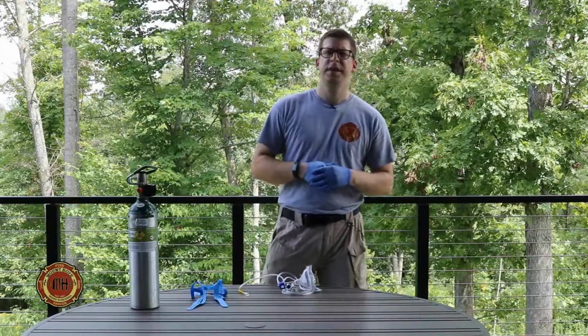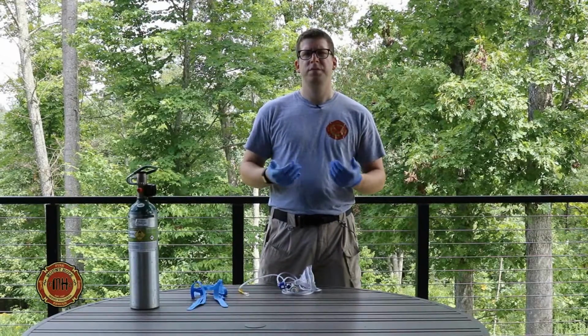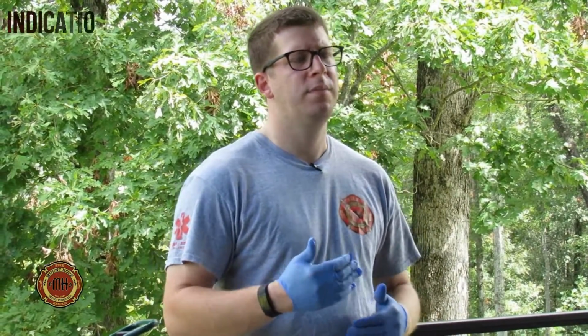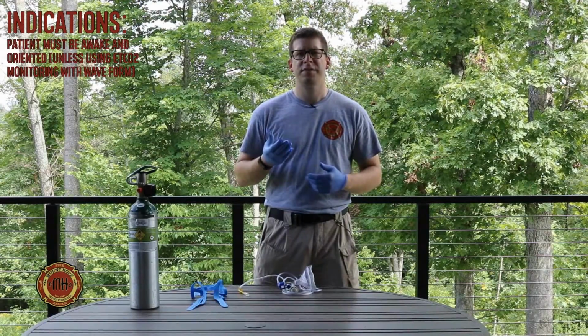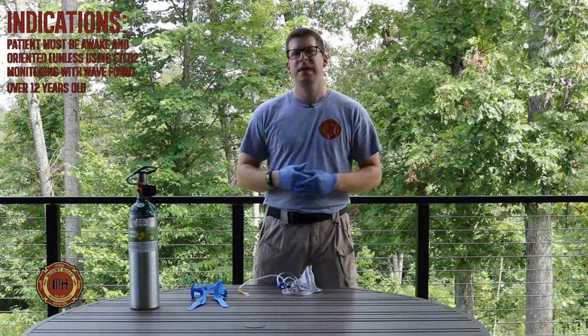Certain characteristics of your patient must be met. Your patient must be awake unless you have end-tidal CO2 monitoring and you can monitor the waveform continuously. Your patient must be above the age of 12 years old, have an open airway which they can maintain themselves, and their blood pressure must be above 90.